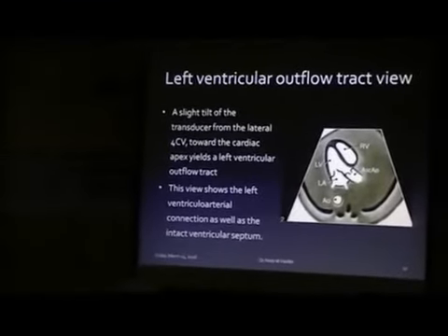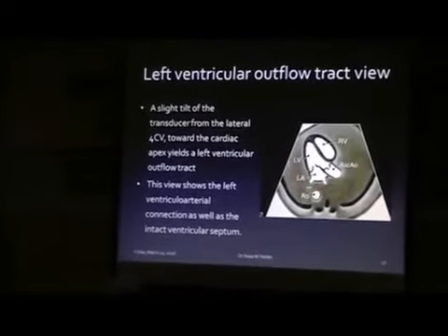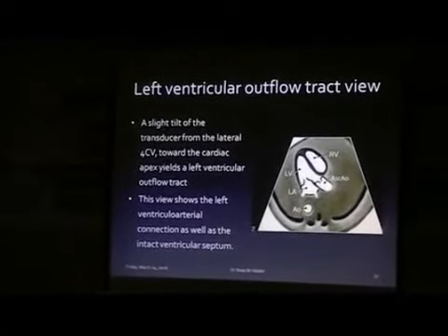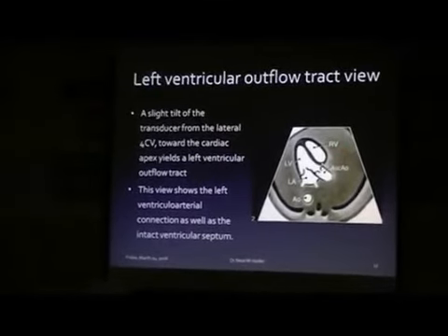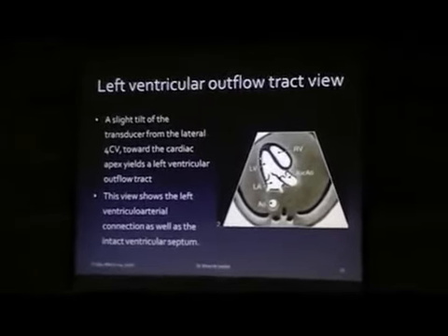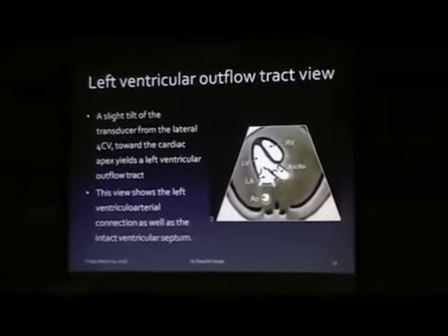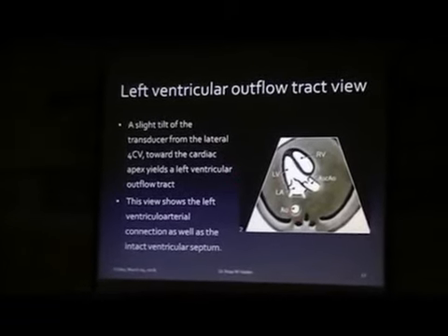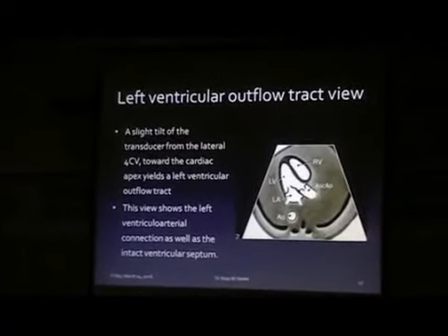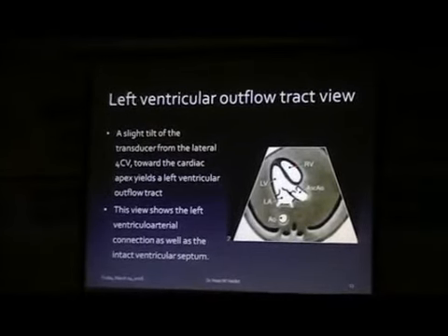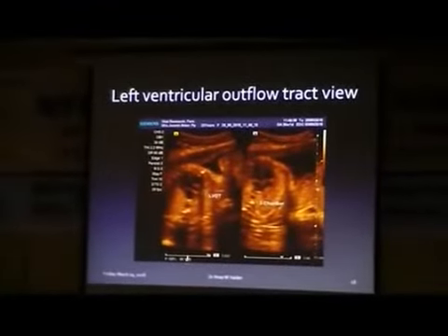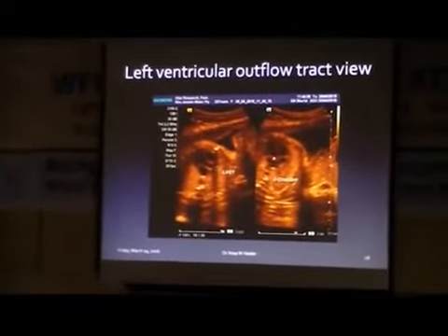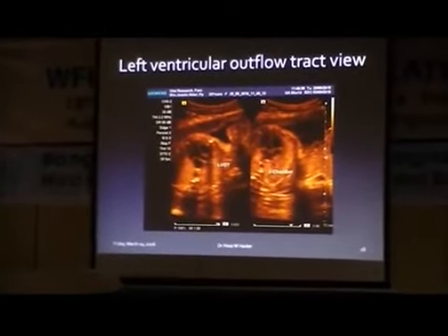This is the left ventricular outflow tract view. In this view we will get all the structures as shown in the four-chamber view, except the right atrium, and here we will get the origin of the ascending aorta from the left ventricle. All structures like the descending aorta, left ventricle, left atrium, and right ventricle are visible. This is the ultrasound scan — this is the left ventricular outflow tract view, this is the four-chamber view, this is the interventricular septum, and this is the descending aorta.